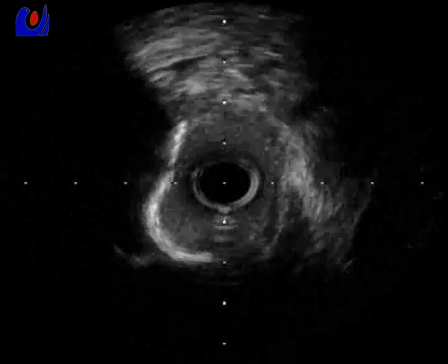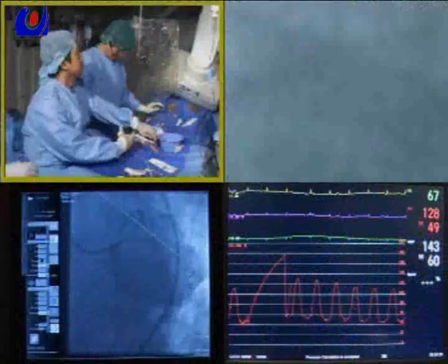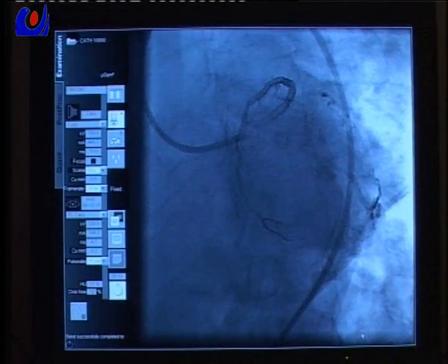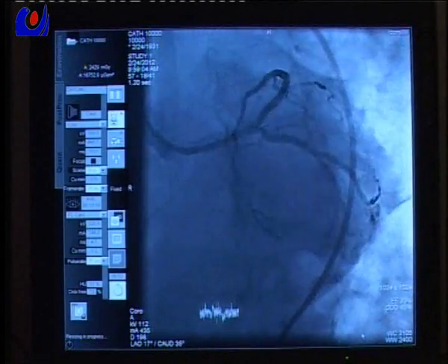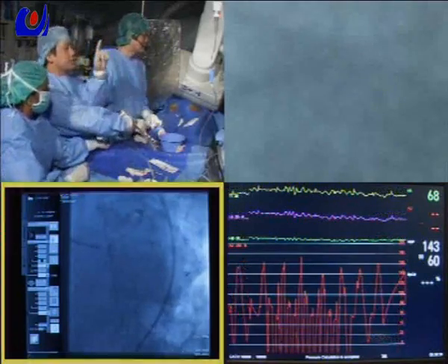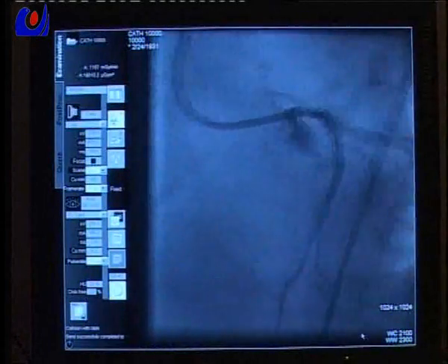Just review it. But I cannot see the LAD wire. Okay, cine. Yeah, some crack here. Okay, we can just stent and after that we decide. We'd like to just do a crossover. Crossover, then we'll see. Cine, because this is a good view for the exact ostium.